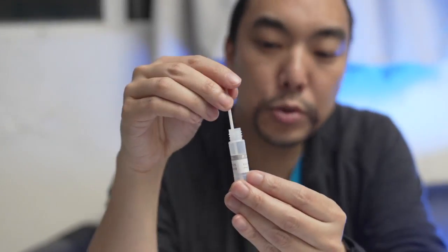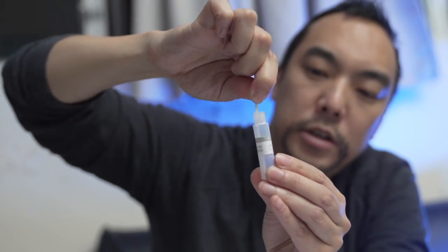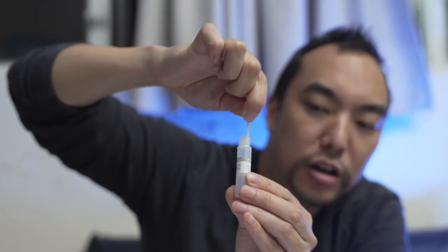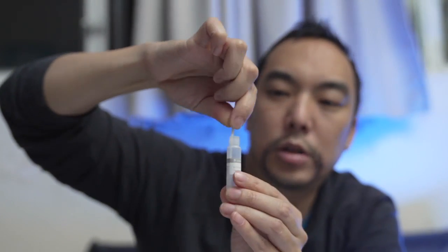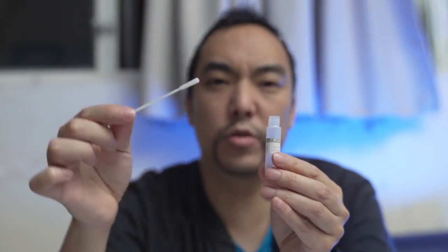And then what you do is you put it in here and then you wiggle it like 5 times. 1, 2, 3, 4, 5, 6, 7, 8, 9, 10. Okay, now that's really mixed. And then this, you need to repeat that 2 or 3 times.